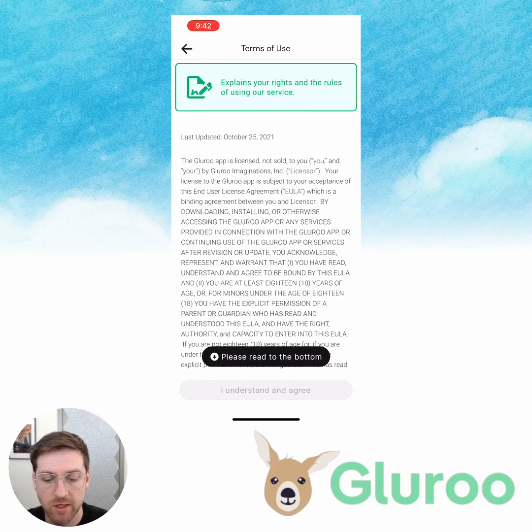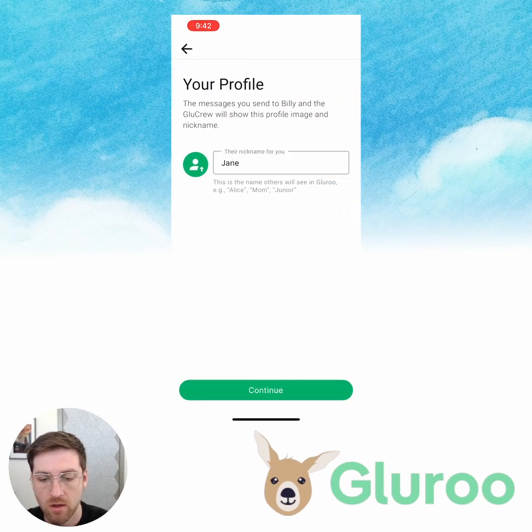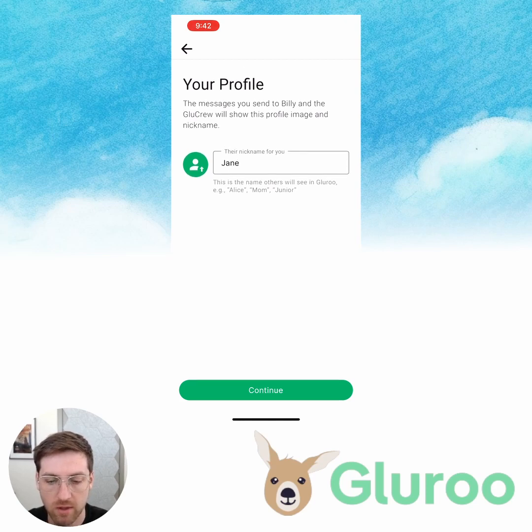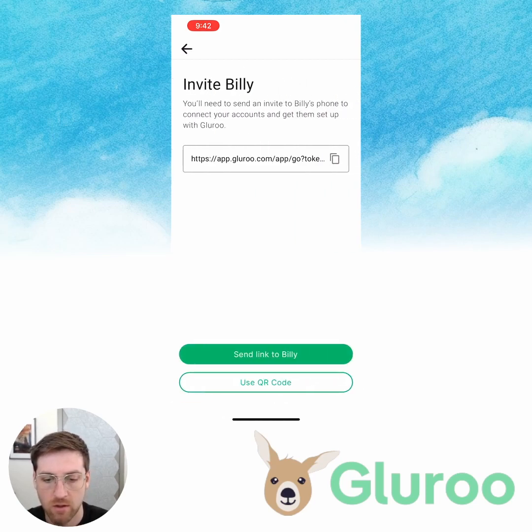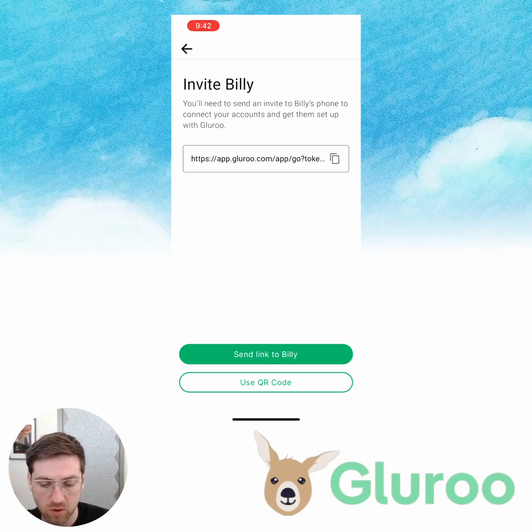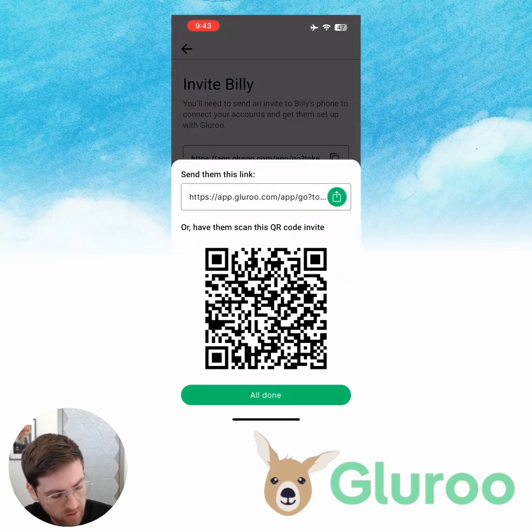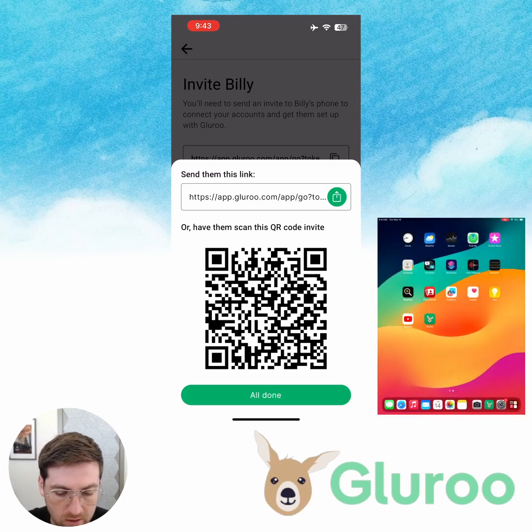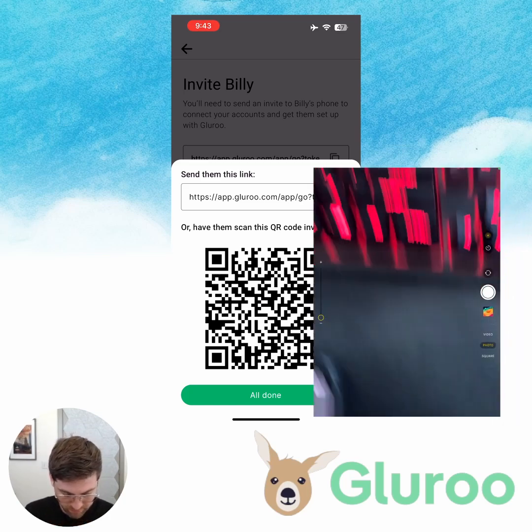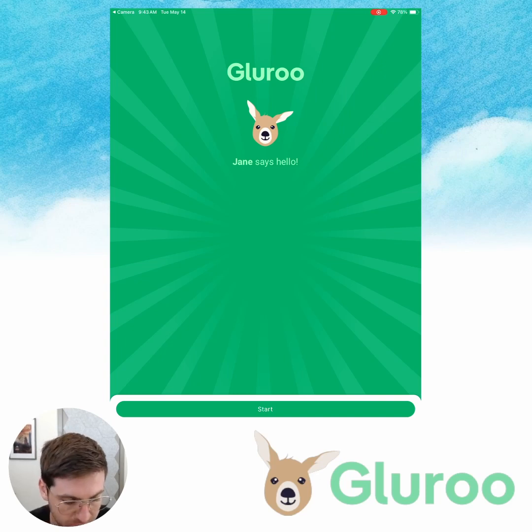Next steps: we're going to read and accept the terms of use, the privacy policy, and medical warnings. For my profile, my name is Jane. I can upload a profile picture here as well so that when Billy pops into my GlueRoo crew, he'll recognize my face. For this step, we can invite Billy a couple of different ways — we can send them a link directly, via email, text it to their phone, or use the QR code. That's what I'm going to do because it's pretty straightforward. You just pull up the QR code, grab the iPad, and open up the camera.